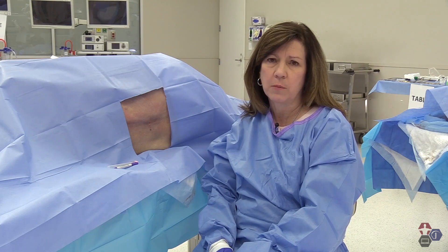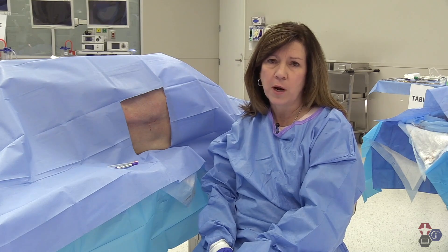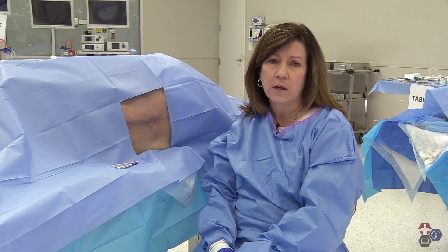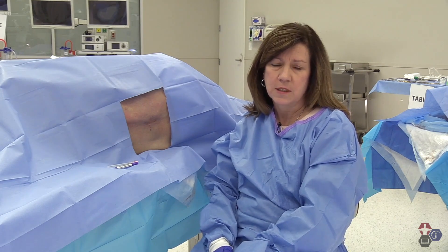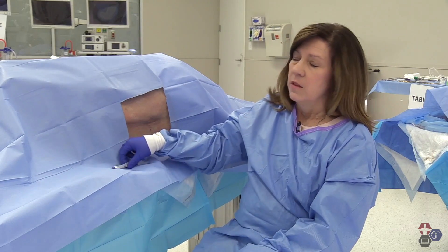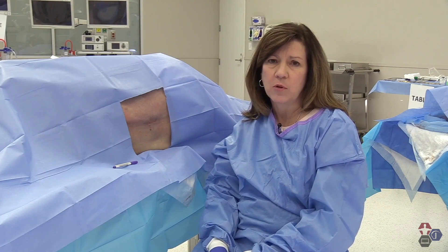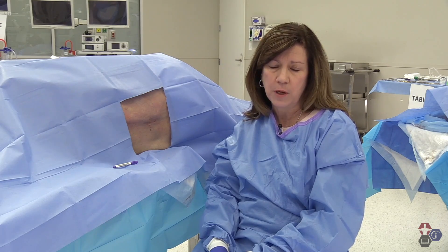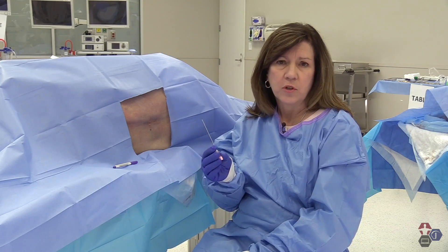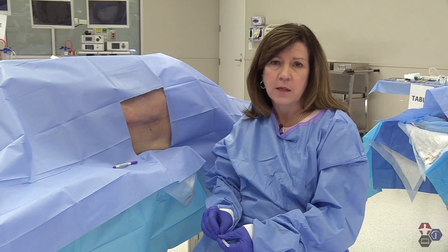When you're in the emergency department you'll have a lumbar puncture tray with a manometer, collection tubes, prep, analgesia, and a number of other things that you need to prepare the area. But for today's presentation I'm going to focus primarily on the anatomy and the procedure itself. The materials that you need are relatively few. It's nice to have some topical lidocaine to anesthetize the area. You need a lumbar puncture needle, which for an adult is usually a 20 or a 22. Children, obviously, would be a lot smaller.